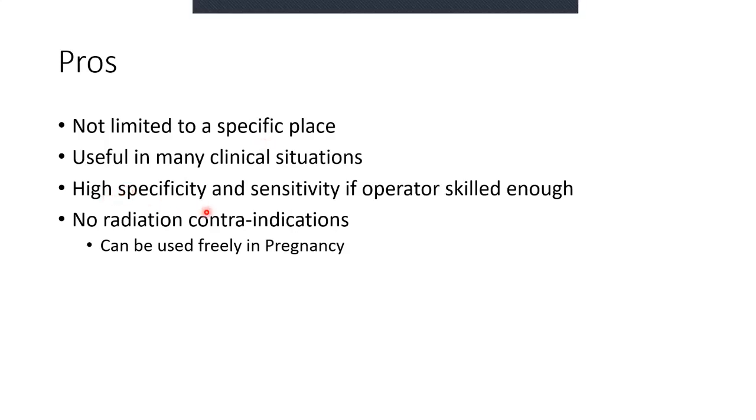It has a high specificity and sensitivity. So it's highly specific for what you may be looking for and very sensitive for what you're looking for if your operator is skilled enough. There's no radiation contraindication, so it can be used freely, absolutely freely in pregnancy. You don't have to worry.